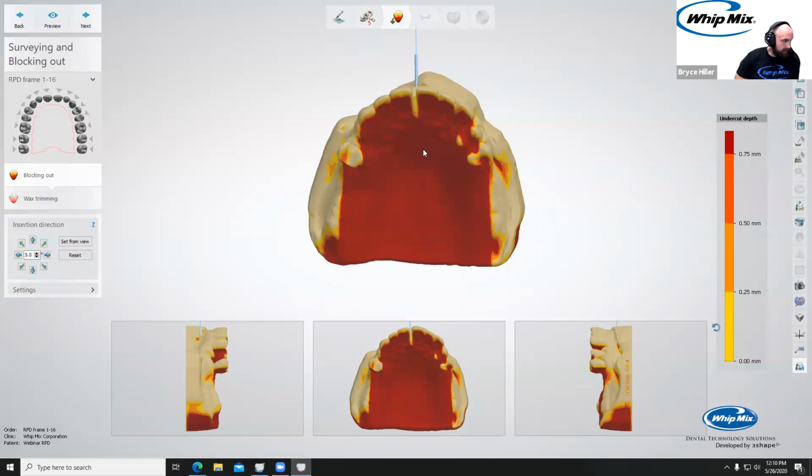The trays themselves, depending on usage, will start to yellow over time. If it gets to the point where you can't see through it at all and it's extremely cloudy, you'll want to replace the tray. It's yellowing and degrading from the strobes of the lights themselves. It happens. We had one in our R&D laboratory that actually cracked at the bottom. That was a good question, and I hope that answered what you were looking for, Henry.